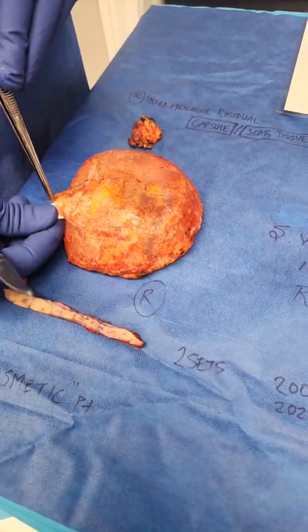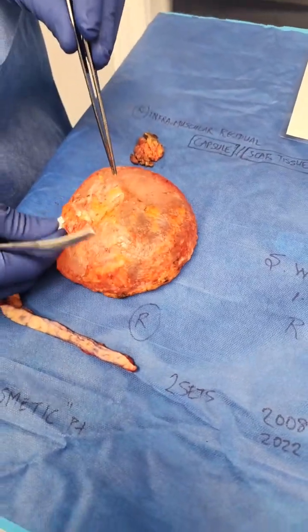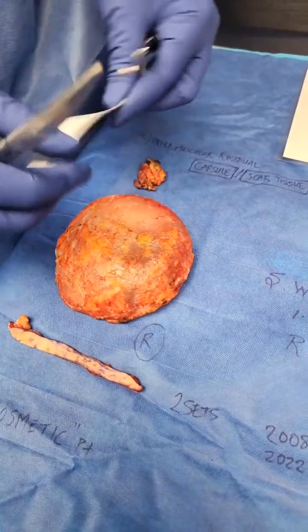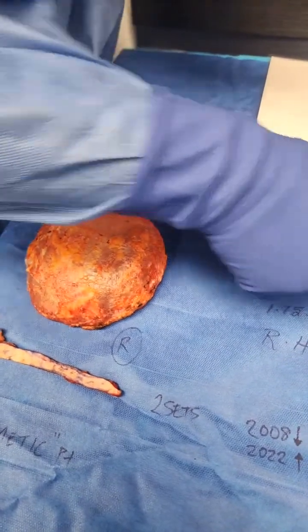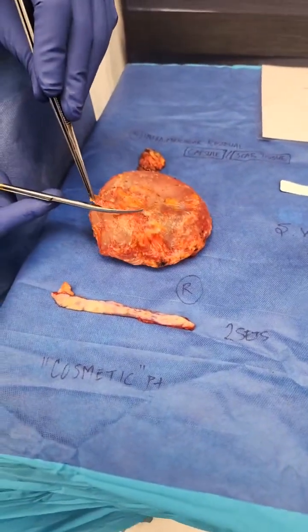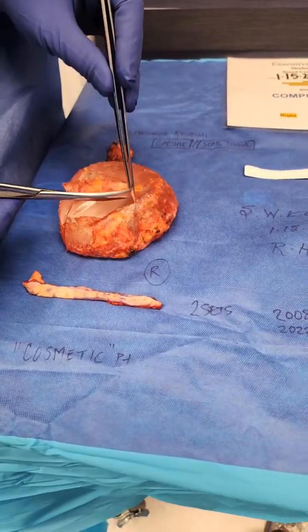Now, no matter how thin the capsule, in my practice, I remove it completely, so that this en bloc is done. God forbid there was fluid on the inside. All of this was going to be removed. When I hear some surgeons say that it was so thin I left the capsule behind, not a good technique in my practice.